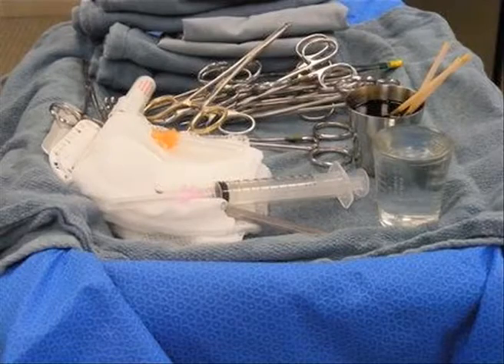And one benefit of dry heat over moist heat sterilization is that certain surgical instruments become dull, lose their luster, or may gather rust in moist heat sterilization. These types of problems are not faced during dry heat sterilization.